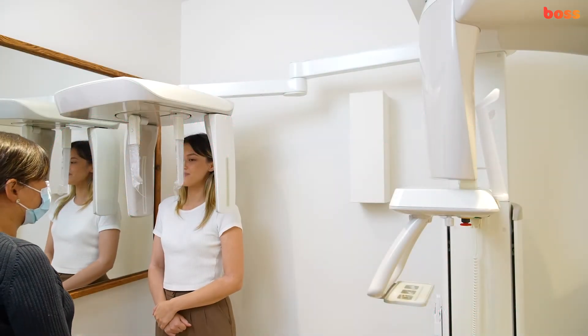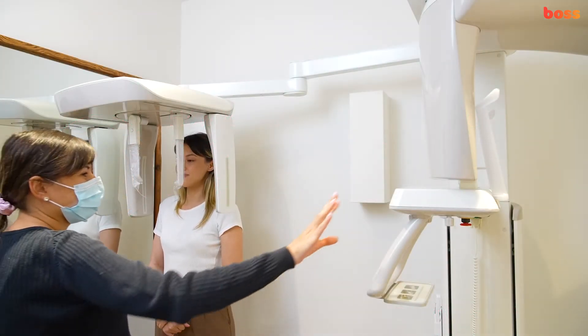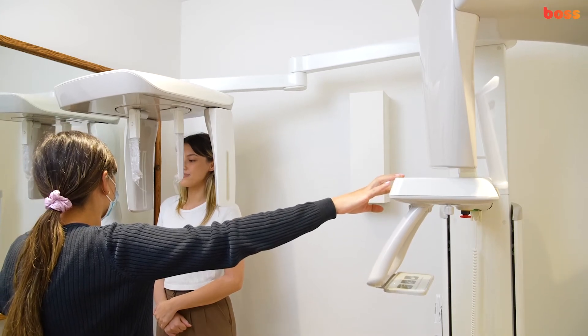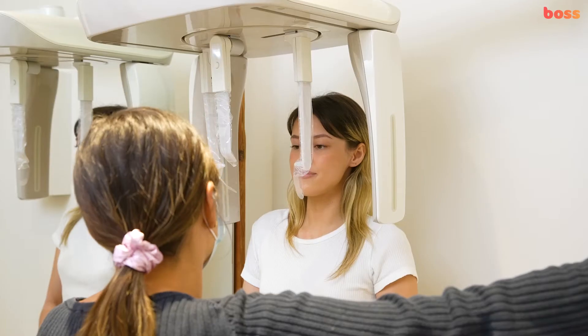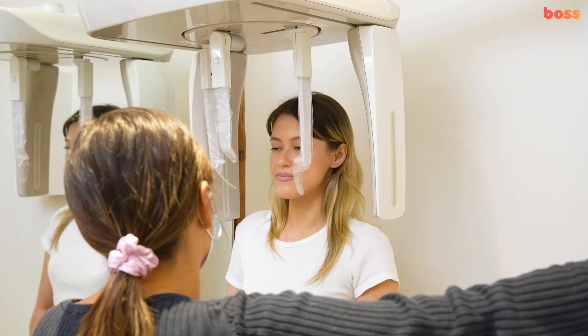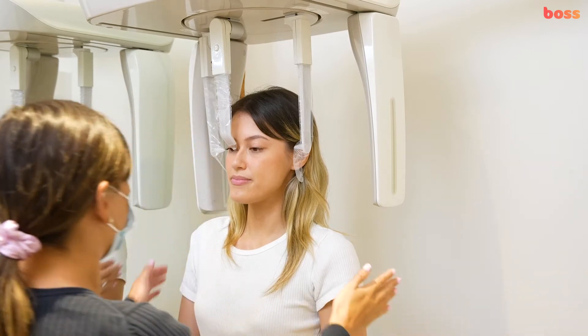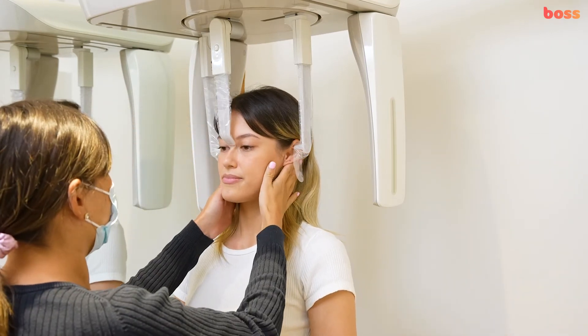This is a video on how to position a patient before taking a LATSEF x-ray. A LATSEF is an x-ray taken of the side of the face with very precise positioning so that various measurements can be made to determine the current and future relationship of the top and bottom jaws.